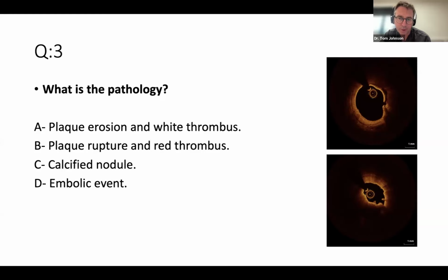But the most important element from that top panel figure is the disruption of the lumen. And then, Adele, what you mentioned about calcium, I think actually I would interpret probably as a breach in the lumen and then probably washout of the underlying material within what's most likely a lipidic plaque. And so you have this differential, again, a kind of not so sharp, but certainly a border on the under edge of the dissected lumen, and then you see a back border, which is probably just where the material of the tissue is.